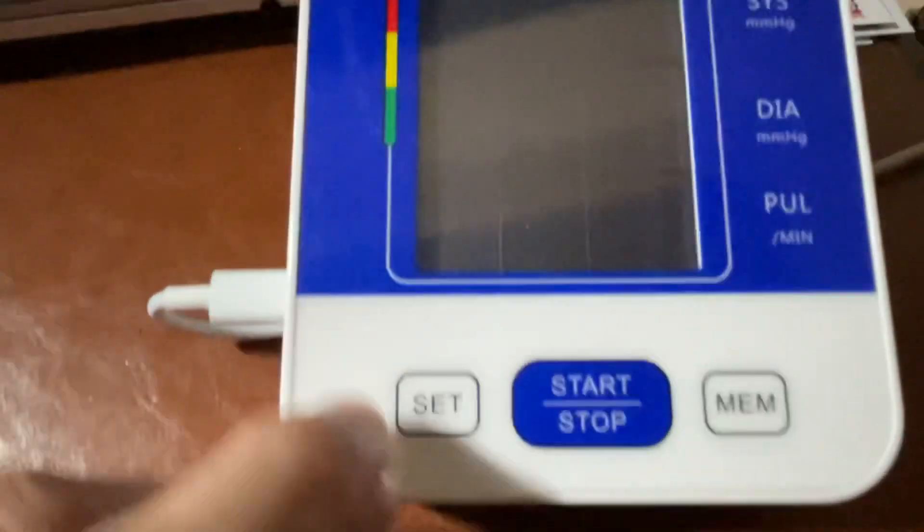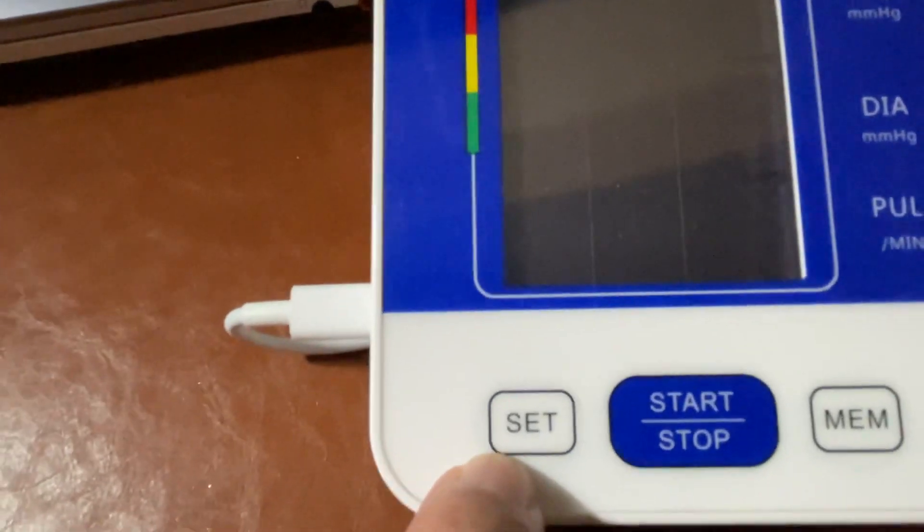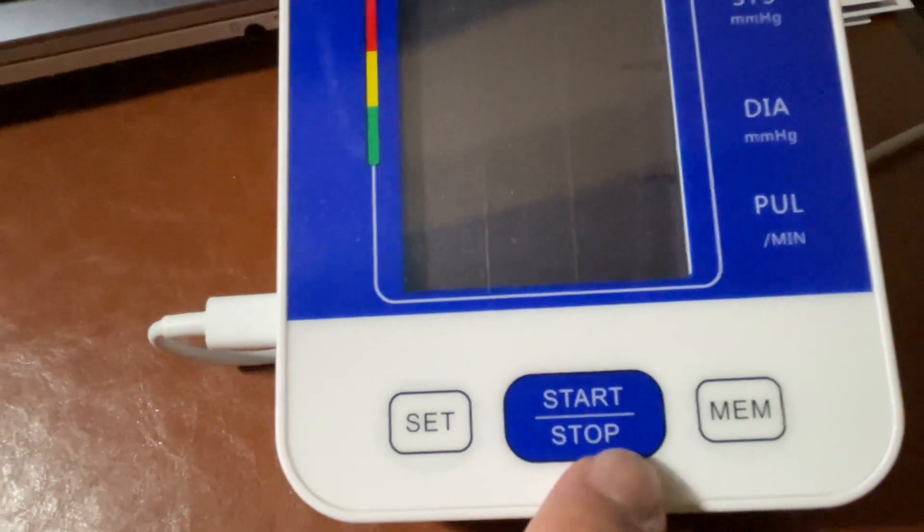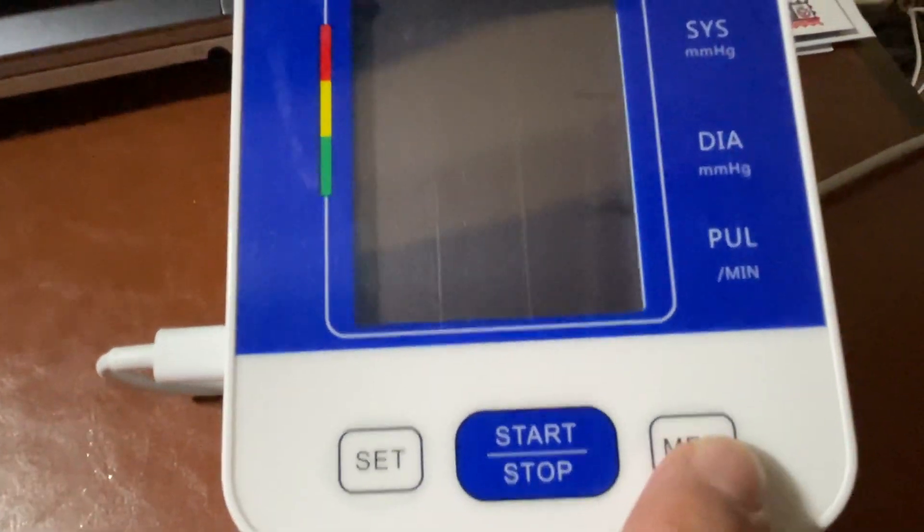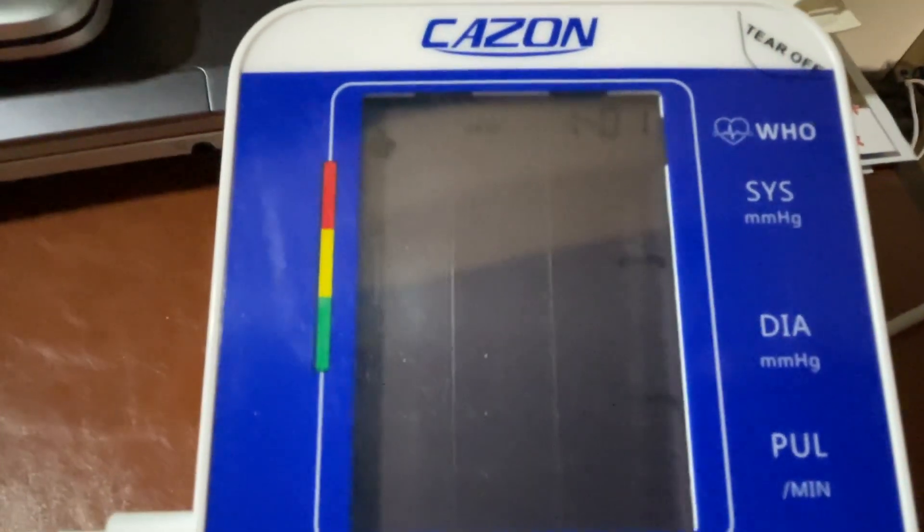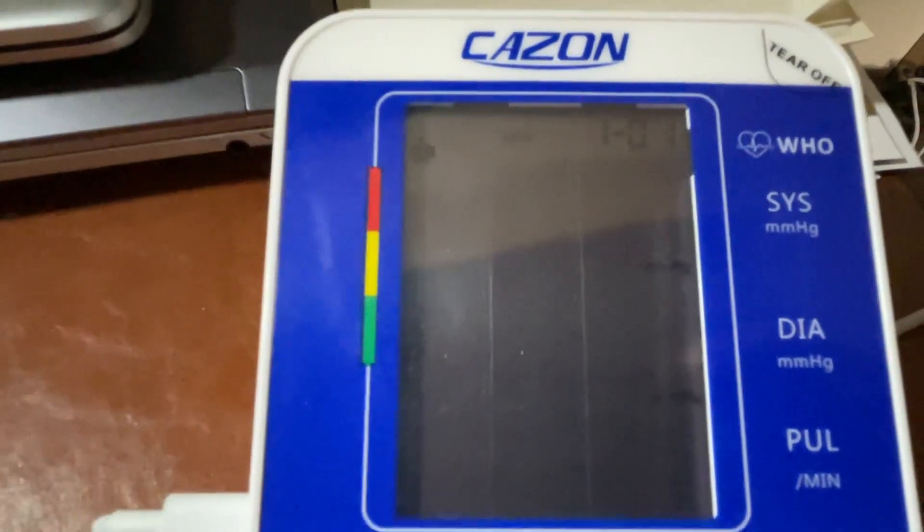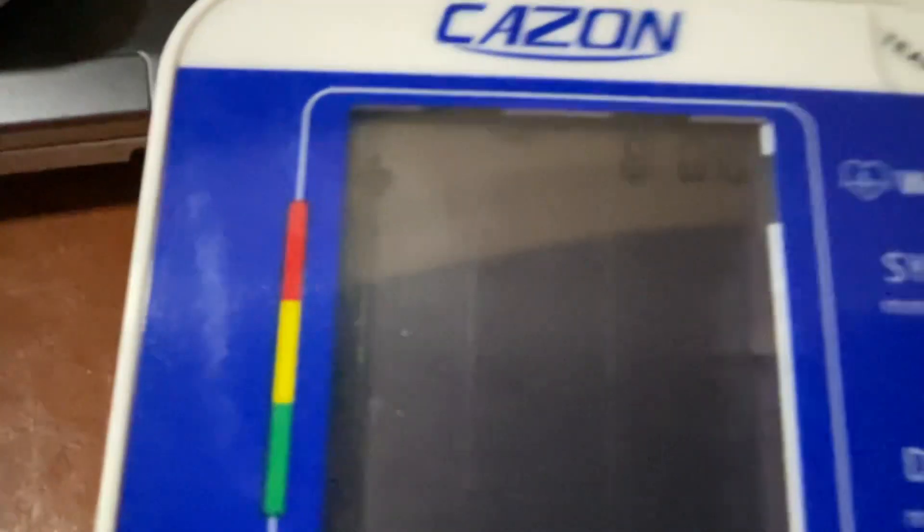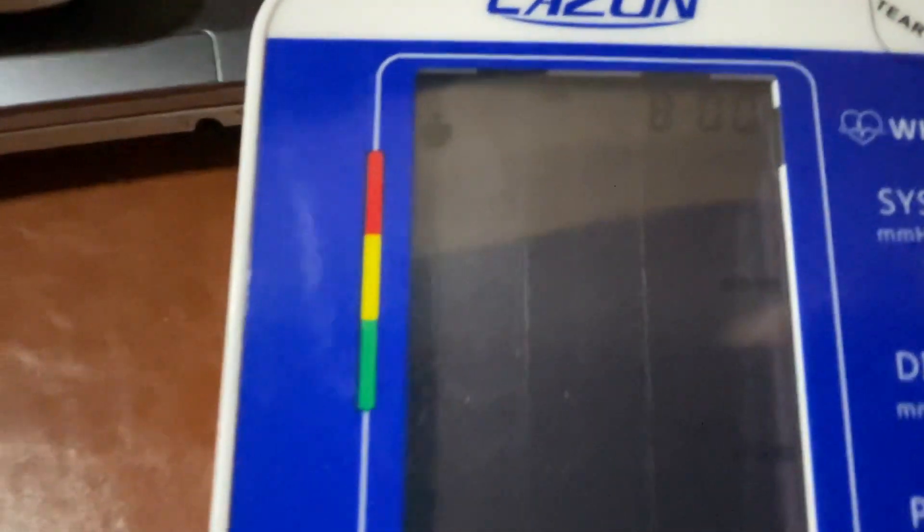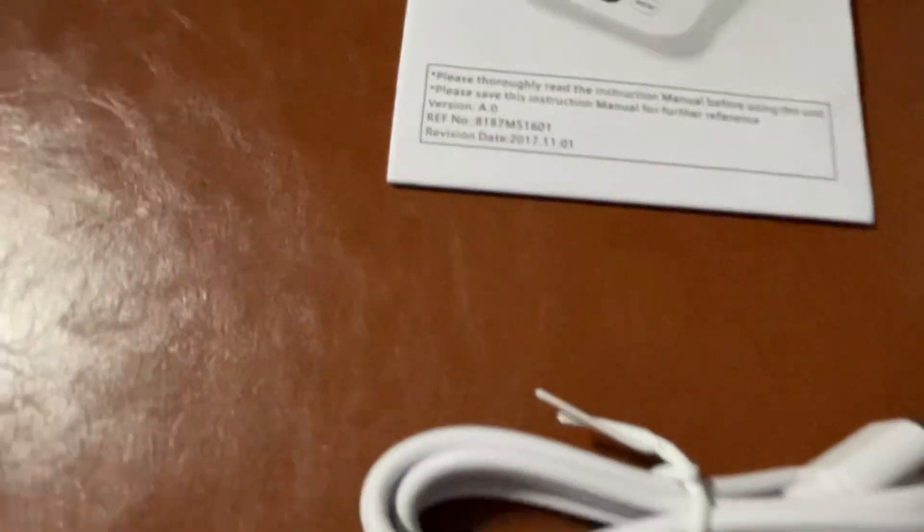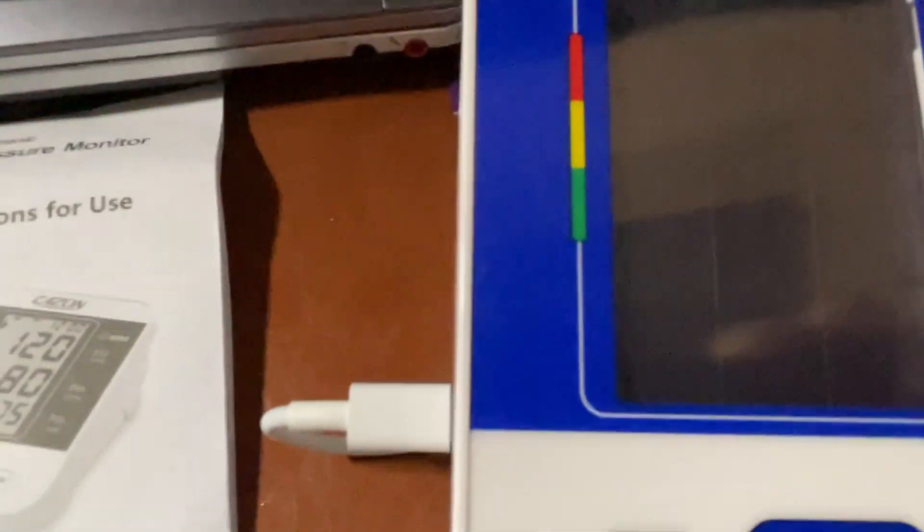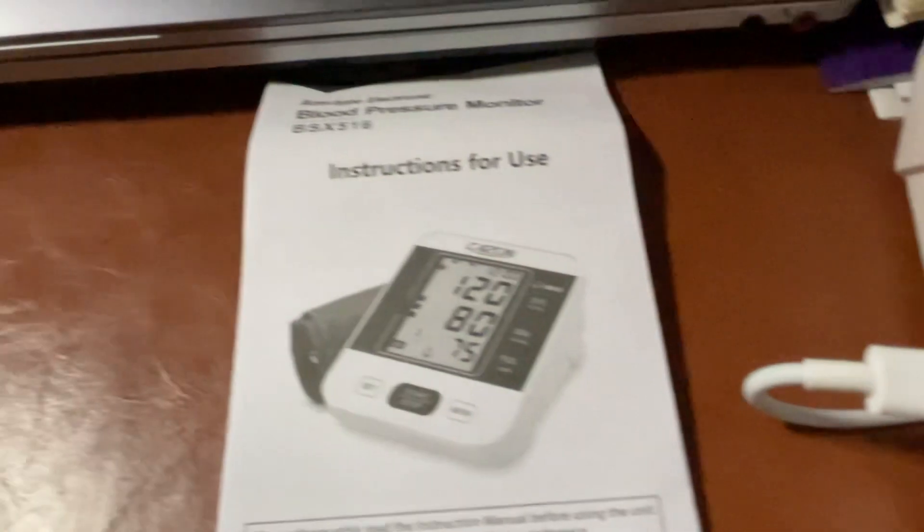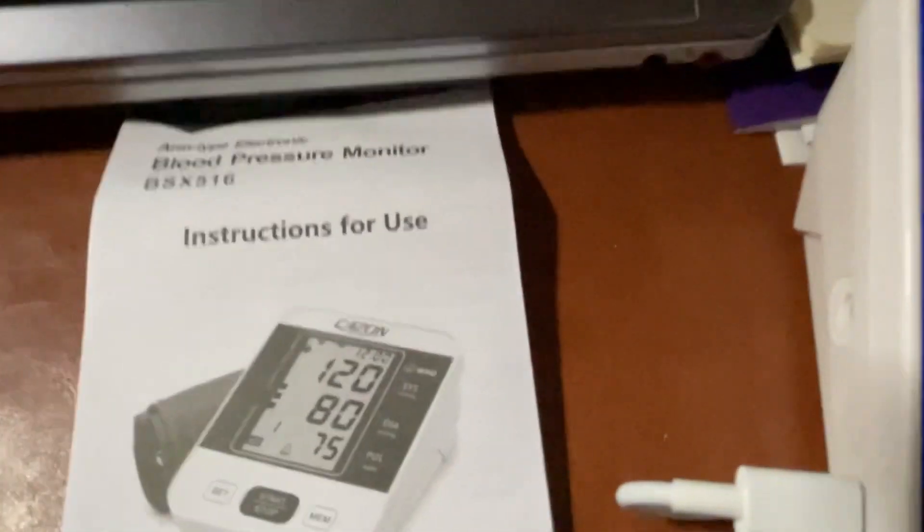You can set the settings here, start and stop button, and the memory. It comes with automatic shutdown.